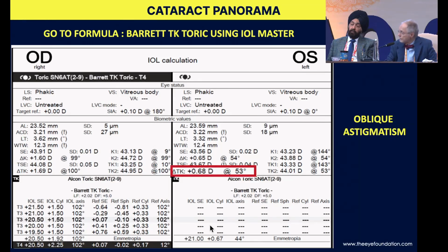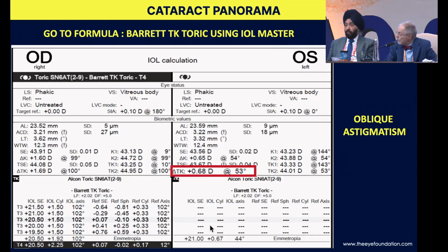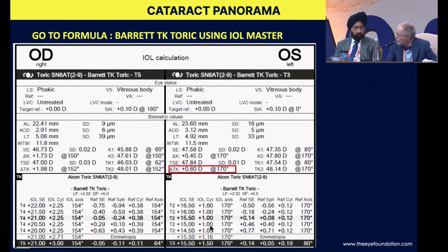Where can you access that? Where can you see the numbers? They're in Veracity, the Zeiss program that amalgamates all of the data, and it shows the predicted astigmatism regardless of how much astigmatism is present. It's very useful. I had a patient who had 0.3 diopters at 30 degrees, and it told me that if I didn't put a toric in, the patient would end up with about 0.6 against the rule, and if I put a toric in, the patient would end up with about 0.4 with the rule, and it was very accurate. And I put a toric in, with a much happier result.